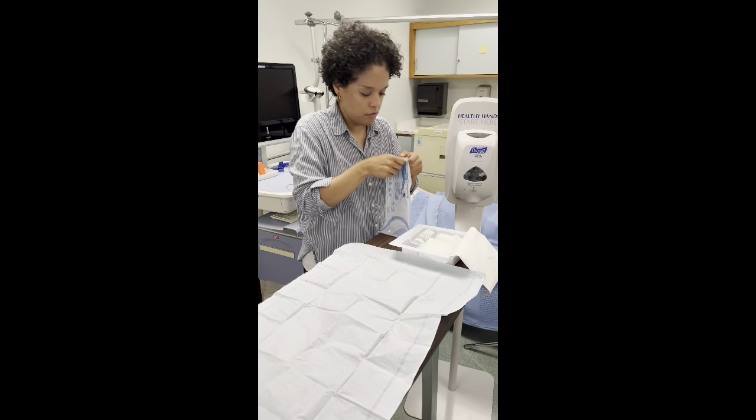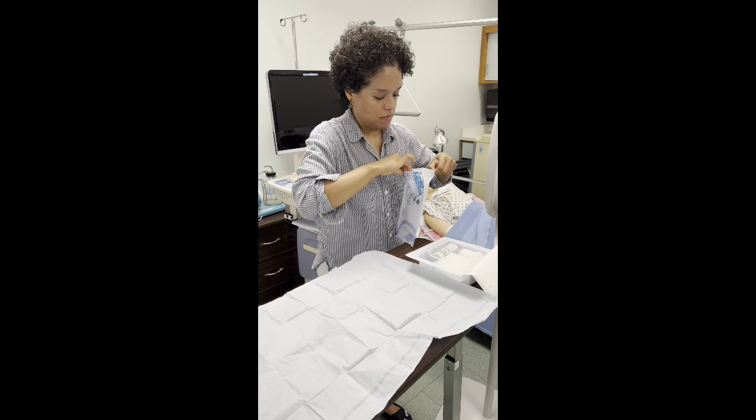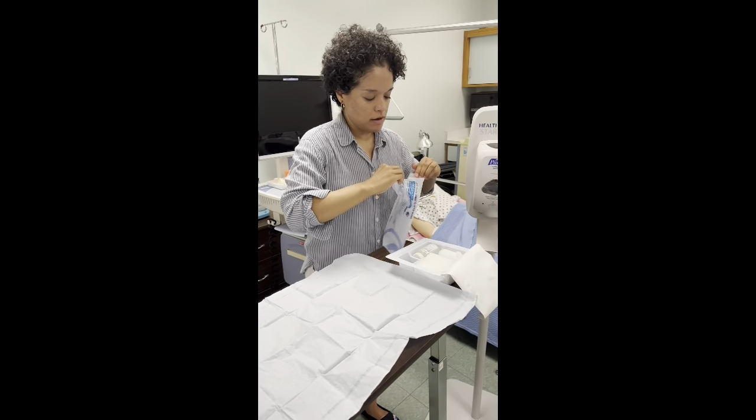Okay, so now I'm going to open my package.